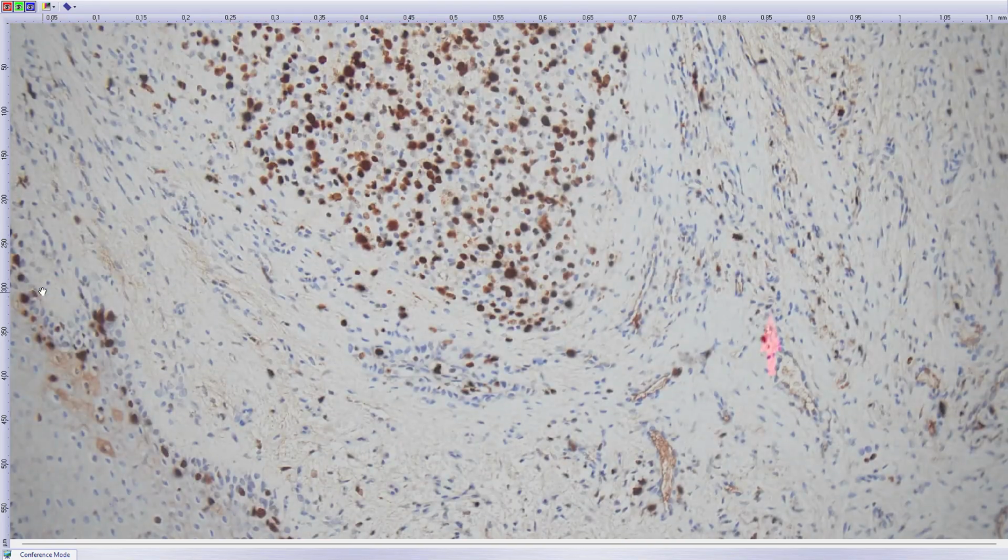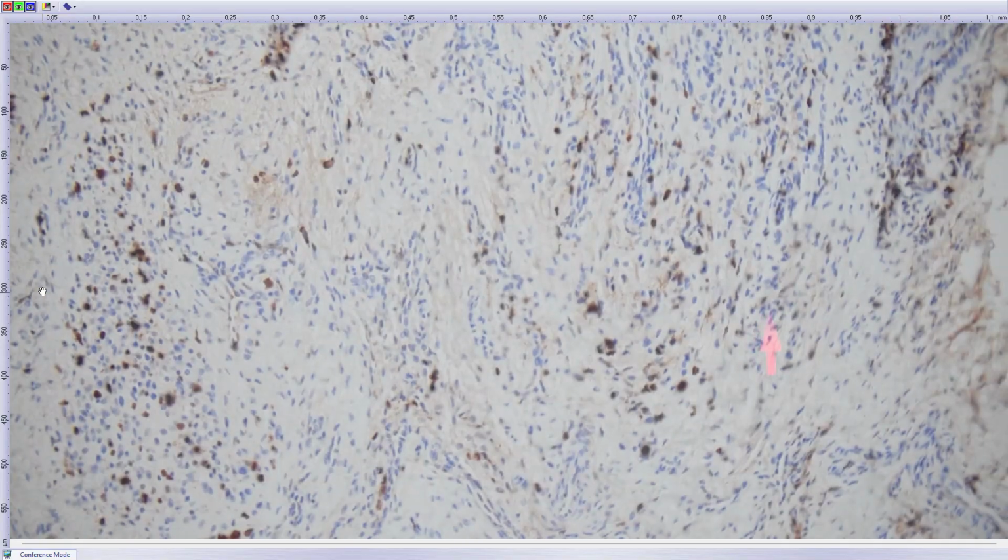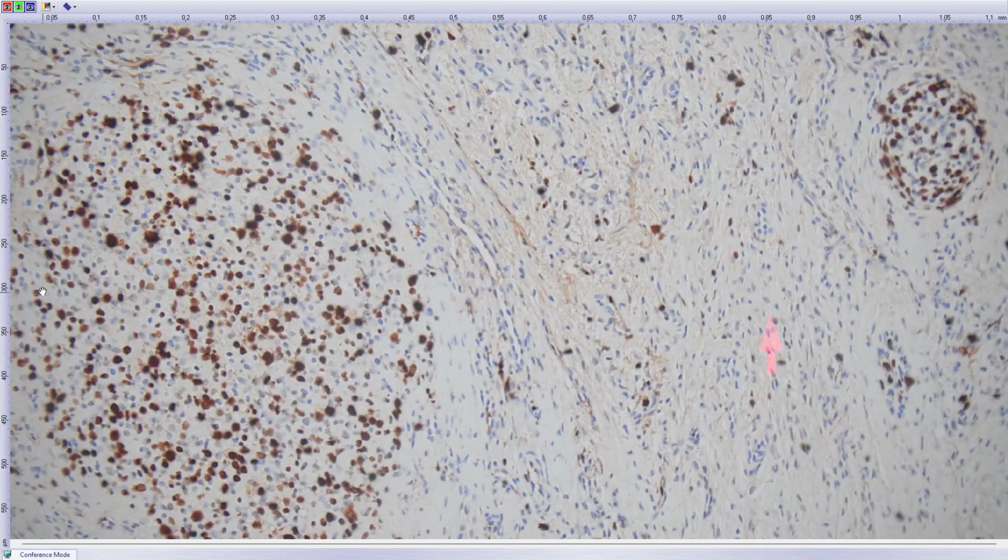When we analyze the data we have from the case, that means especially KIT mutation, which is a typical mutation for melanomas arising in sun-exposed areas. Yeah. We think it is small cell melanoma arising in the leg.